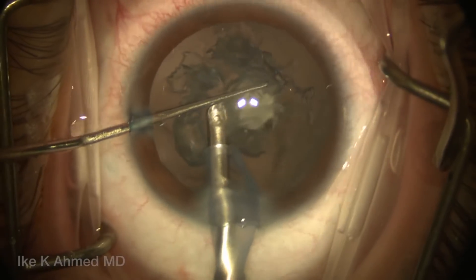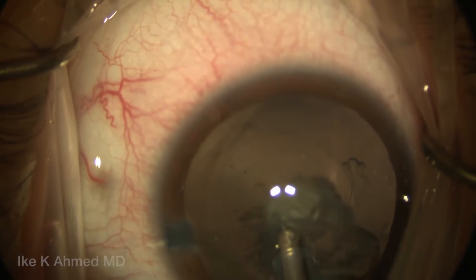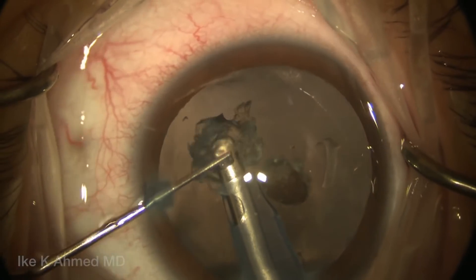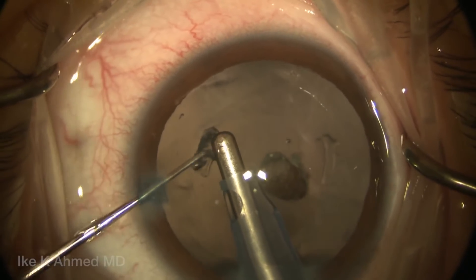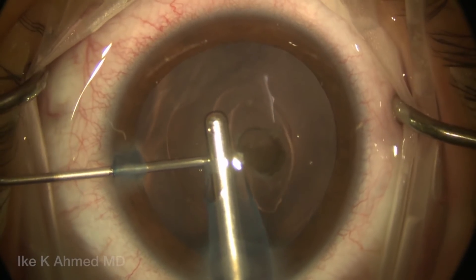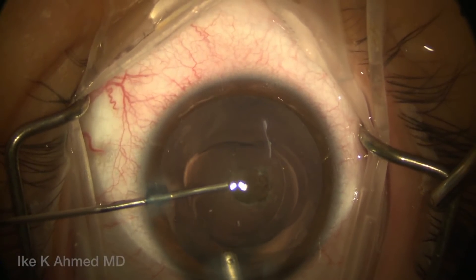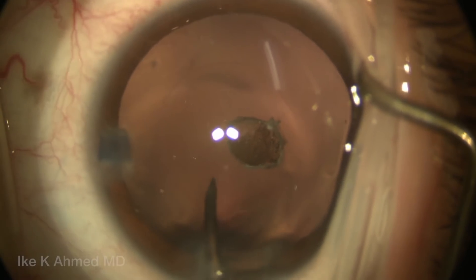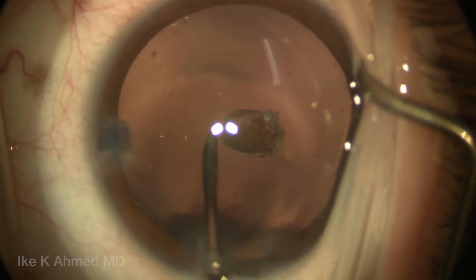You can see I'm using a Kuglen hook here to keep that plaque down so we don't aspirate it just yet. The final position here with that posterior aspect of the epinucleus, we're going to remove it with the posterior polar opacity, and we're using a Kuglen hook to help aspirate it out. What's left is the pigmented area along that posterior capsule — it does look fairly thin, if not necessarily intact — and you can see the posterior outpouching in this example of posterior polar, or in this case lenticonus.